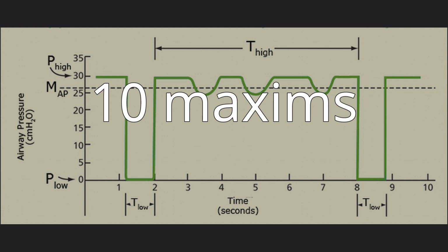Within each ventilatory pattern there are several variations that can be distinguished by their targeting schemes. A targeting scheme is a description of how the ventilator achieves preset targets. A target is a predetermined goal of ventilator output. Examples of within-breath targets include inspiratory flow or pressure and rise time for setpoint targeting, tidal volume for dual targeting, and constant of proportionality between inspiratory pressure and patient effort for servo targeting.